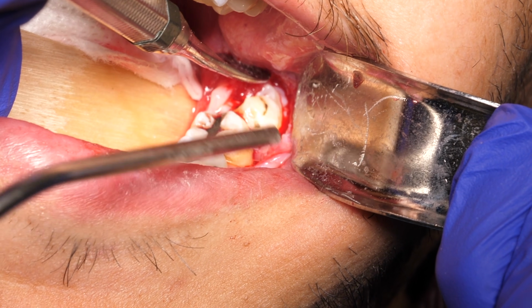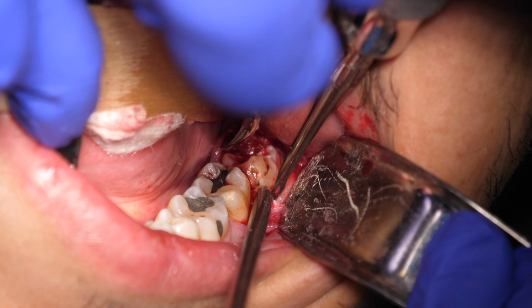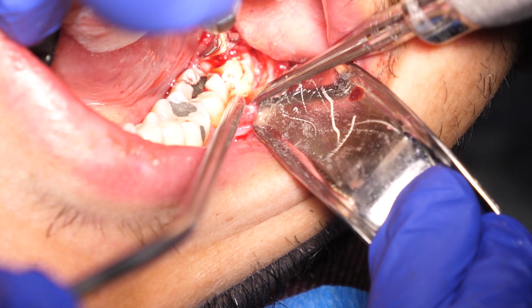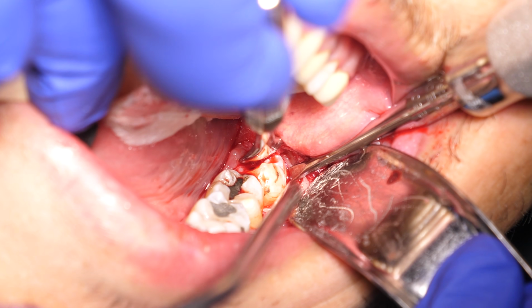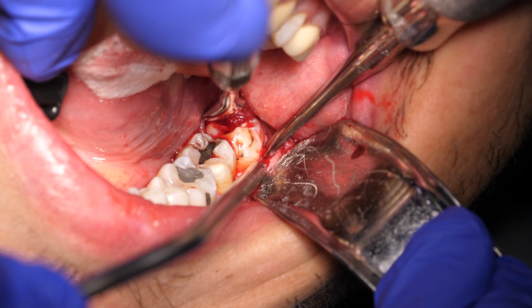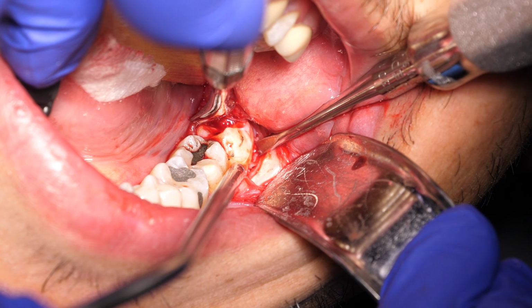After creating a buccal trough, an attempt to elevate the tooth is made. In this case, the tooth was easily mobilized with an elevator and did not require sectioning. When using an elevator, one has to be careful to choose the right size, a small, medium, or large. Always make sure when elevating to have a finger rest to prevent slippage and damage to adjacent structures.